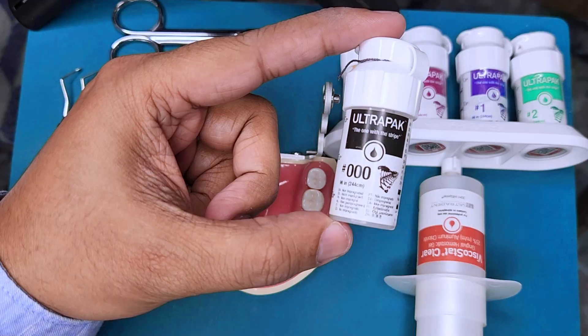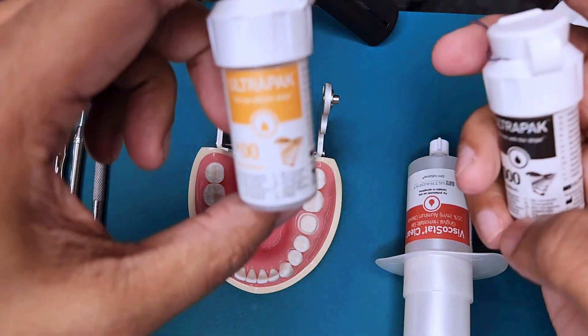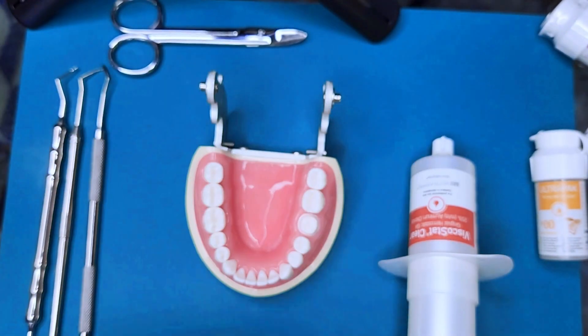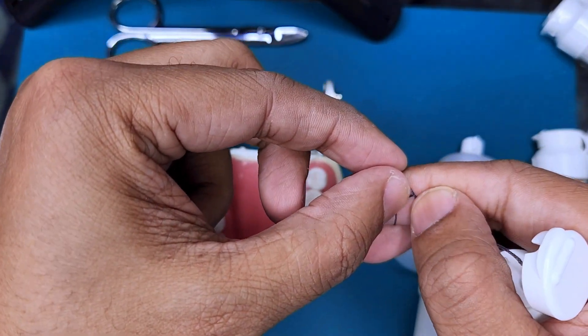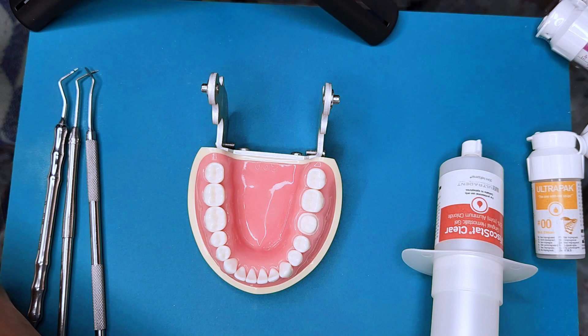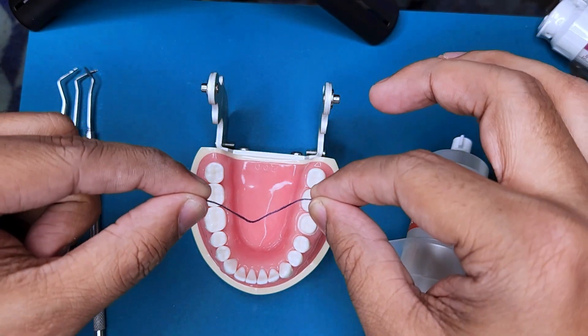If you are doing cord packing for multiple teeth — say 10 veneer preparations — I like to use a single long cord rather than strips of small cords. To decide the exact length, I use the finger wrap technique: wrap the cord around your finger, and the amount of cord that comes in is exactly what you need for a molar. For a central or lateral incisor, take a little less or a little more.